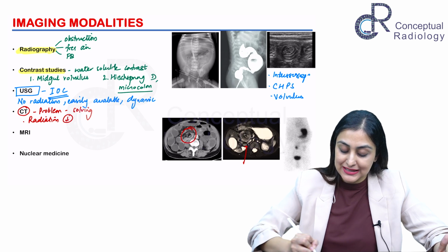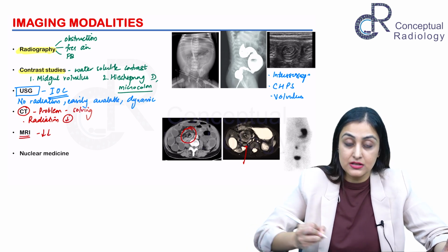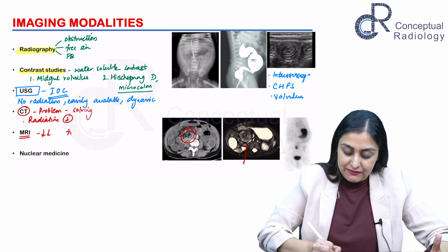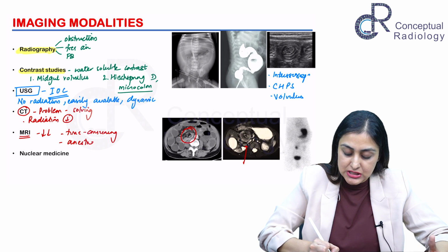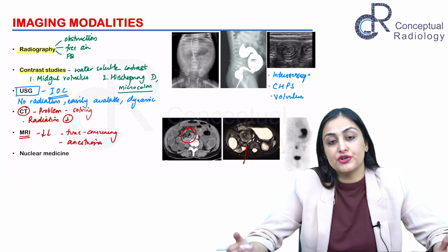Same job is done by the MRI, but MRI, remember, in infants has a very little role because it is going to take a lot of time. We don't have time. It's an emergency. Plus, we would need additional anesthesia in children for them to remain still, particularly in infants. So MRI is not something that we would prefer a lot.